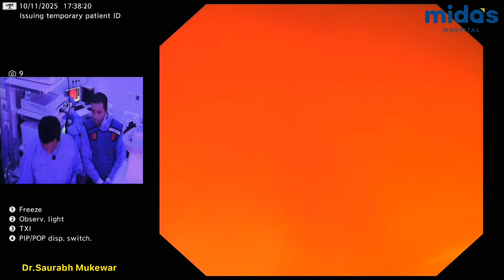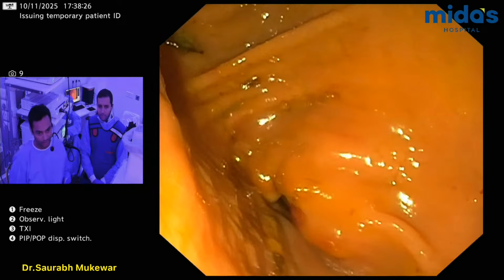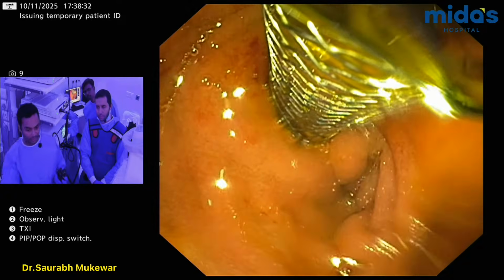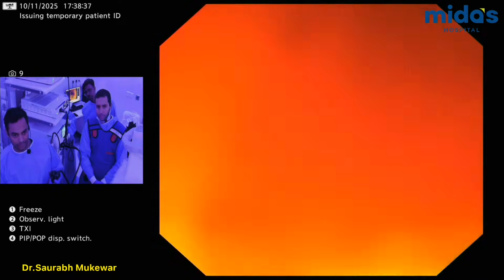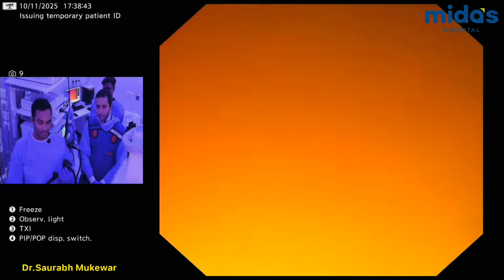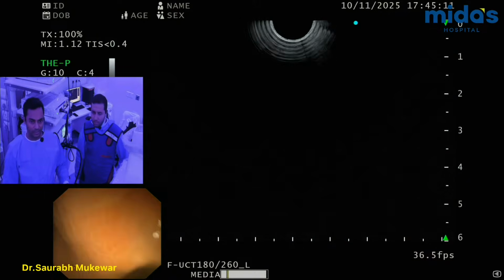So again, I would not recommend doing such a case when you're starting out. This is fine. I mean, I've been doing it quite a bit, so I had the comfort of taking that risk in my maneuvering, but again, looking at the angles, the way things were, the sharp bend, sometimes can be a task. Then you mess it up, then it's a total shit show, because then it's like bile leak and it's annoying, and I've had a couple of bile leaks with such cases, therefore.